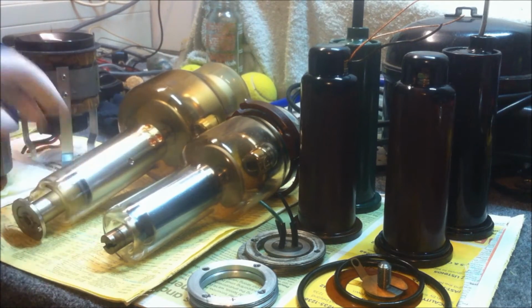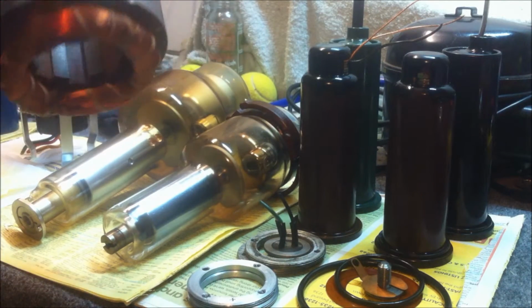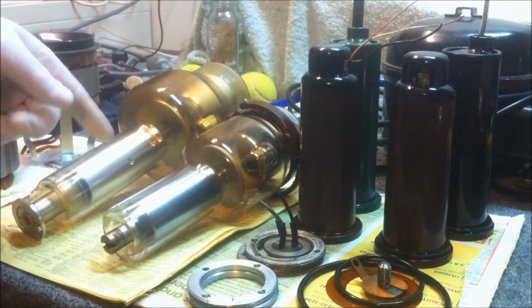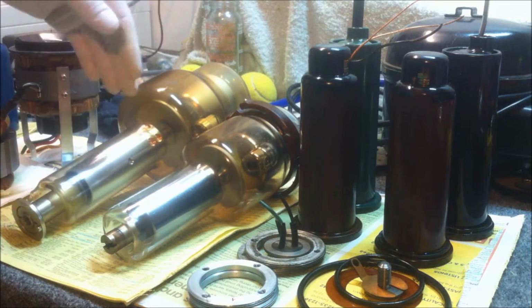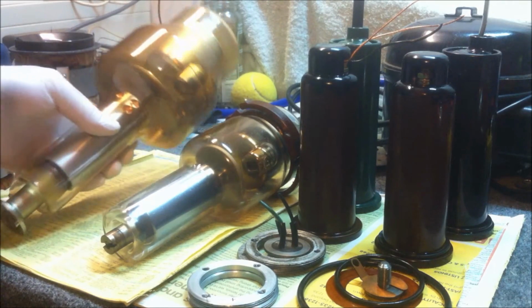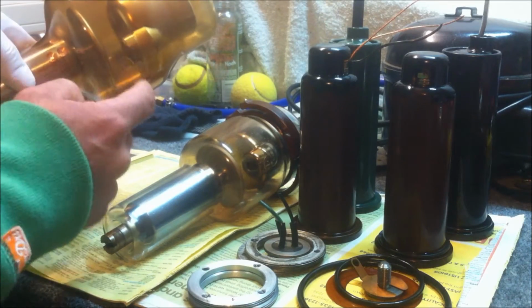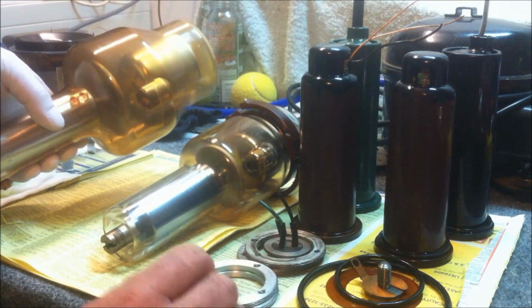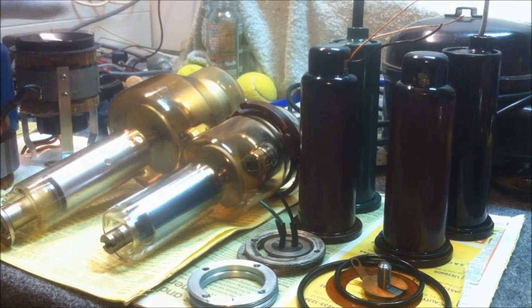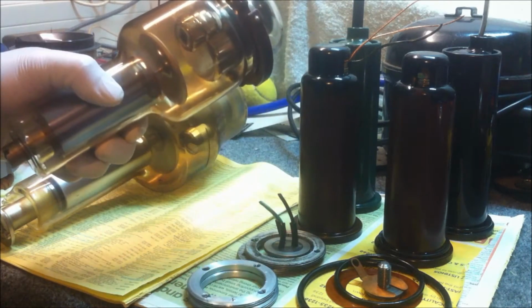And that anode actually sat inside this winding here, so this winding would be pulsed with either pulsed DC or AC, and that would cause this assembly to rotate, allowing more energy to be emitted from the surface of that tungsten target. And you can see that they've got the glass window here, so that's where most of the X-rays would be shooting out. So I've got both of the windings for both of them.